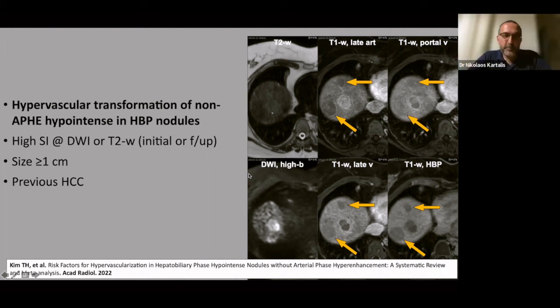In my institution, we would be a bit more careful, but I think it's a paradigm shift. If I'm not completely wrong, in next versions of the LI-RADS, at least I have heard some discussions of people working with LI-RADS, that the hepatobiliary phase will probably get a bit more dignity in the future.